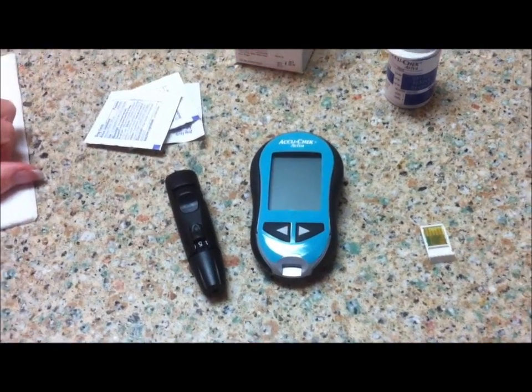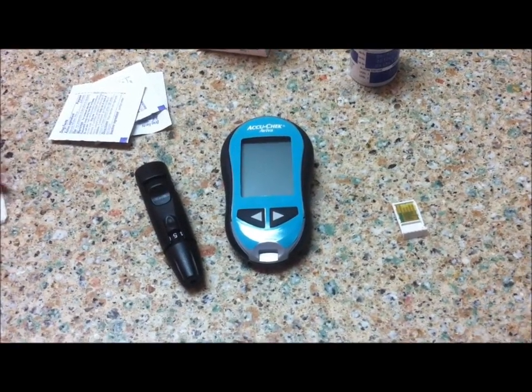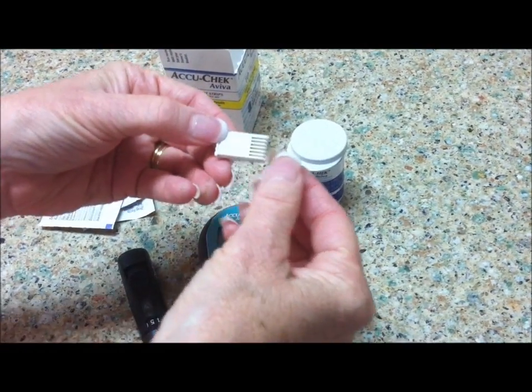This is a video demonstration on the use of the AccuCheck Aviva blood glucose meter. The first thing you'll notice about the meter is that in every box, there's a set of strips and a code chip.